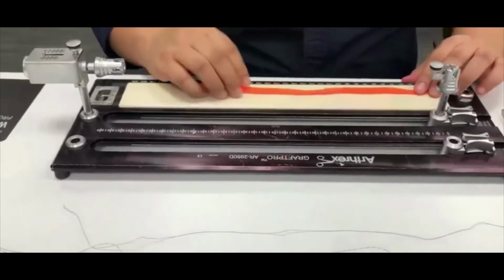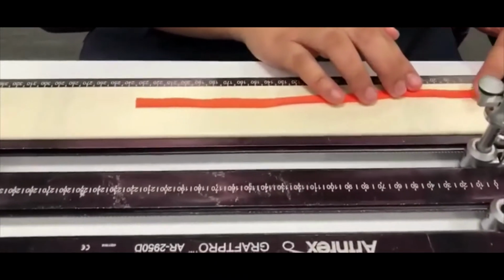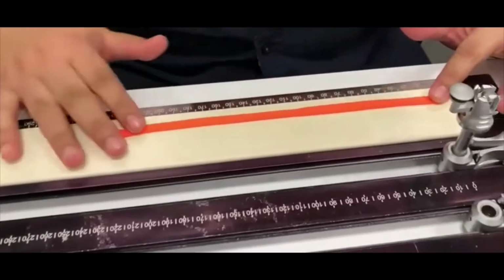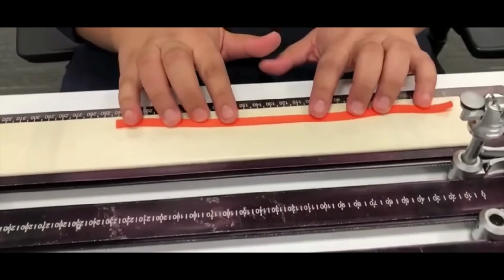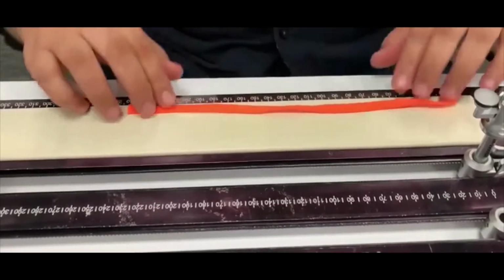Prof will always harvest the graft. After harvesting the graft, we will clean it. Once it is clean, Prof will always say take the best 240. So we will cut about 240. This shoelace is just to simulate the graft. Okay, good.